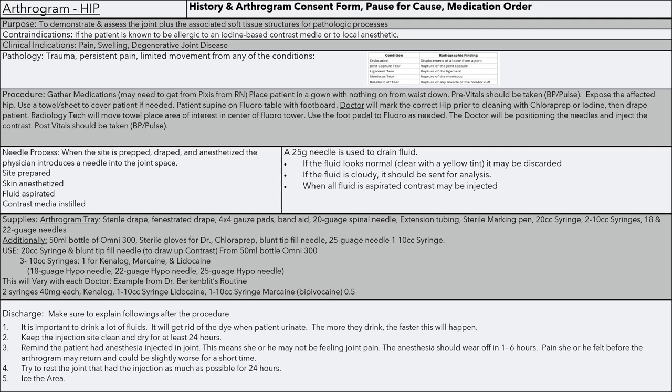Additionally, you're going to need a bottle of contrast — at our facility we use Omni, depending on your facility — sterile gloves for the physician, chloroprep, and whatever you use to anesthetize the area, a blunt tip-fill needle, a 25-gauge needle, and one 10-cc syringe. You'll use a 20-cc syringe and a blunt tip-fill needle to draw contrast from your 50-milliliter bottle of Omni. Your three 10-cc syringes: one for Kenalog, one for Marcaine, and one for Lidocaine. Your 18-, 22-, and 25-gauge hypo needles will be attached to those syringes. This will vary with each doctor.